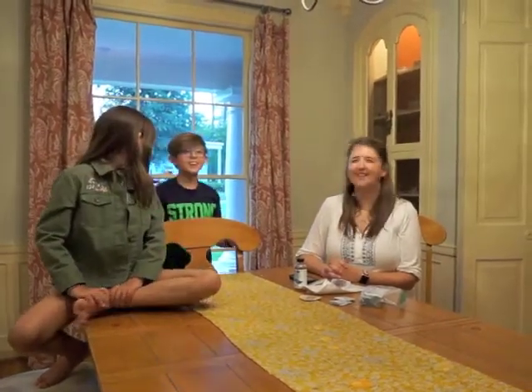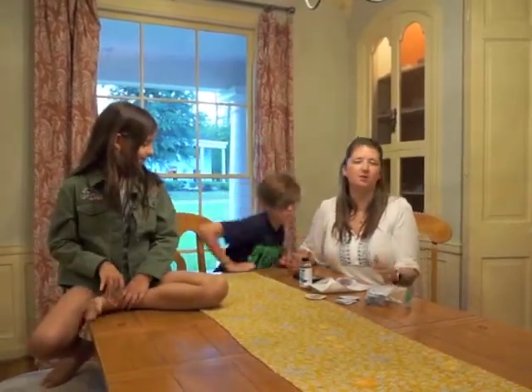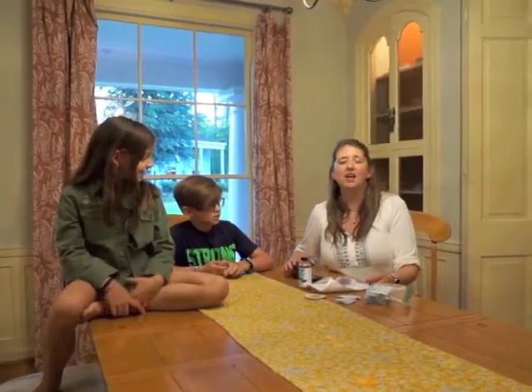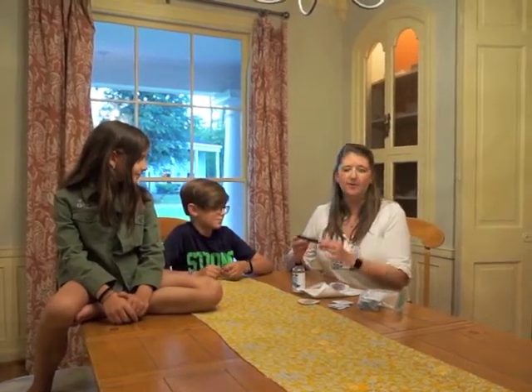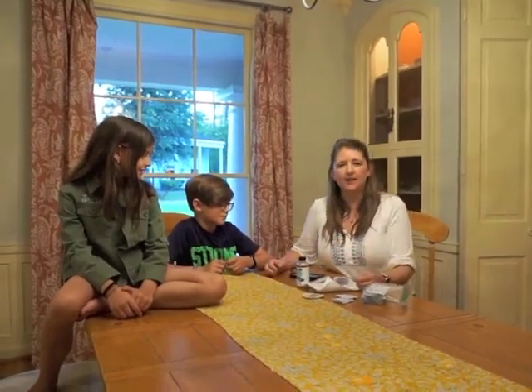Hey guys, it's me, Amelia, and today we are going to be changing the Dexcom G5. Q has a CGM now, which is short for Continuous Glucose Monitor, and it monitors his blood sugar 24 hours a day. We get the readings on his phone, so he has a lot less finger pricks.